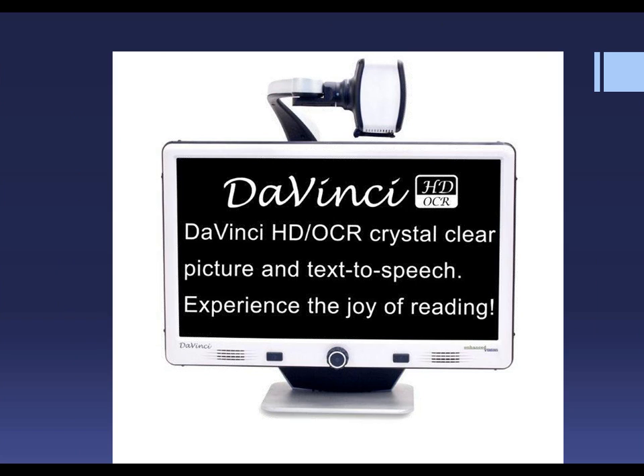The DaVinci is our very newest electronic magnifier. It has HD, OCR, crystal clear picture, and text-to-speech. Not only does it enlarge things, it also reads to you with very understandable speech, and it will even highlight the word as it's being read. I see so many applications for this — not only for older individuals that may have suffered a stroke and are learning to read again, but also for the student with dyslexia. The uses for this are infinite.